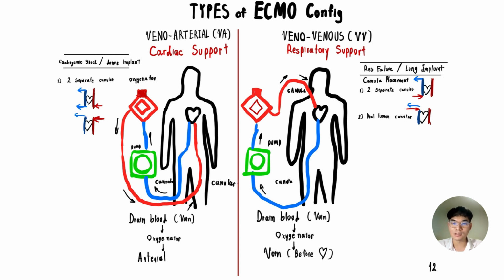However, after the oxygenation process is finished, the blood is returned not to the venous system, but instead is infused into the arterial site, typically the femoral artery. This approach allows the oxygenated blood direct delivery into the arterial system efficiently and bypasses both heart and lung function, which is crucial in scenarios where heart pumping capability is severely compromised. This arterial infusion helps maintain the perfusion pressure to critical organs despite cardiac insufficiency.